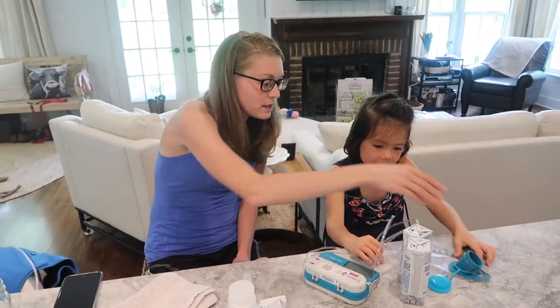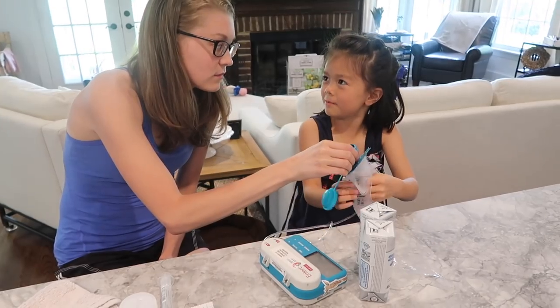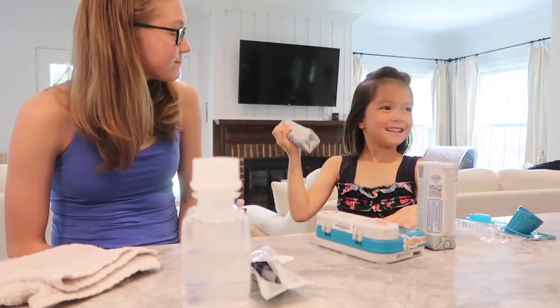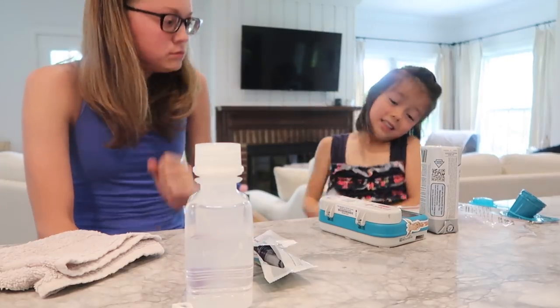Now you would pick this bag up, and I'm just going to warn you — you have to like pull the back of the bag away so it doesn't come back out and overflow. Yep. That's good.